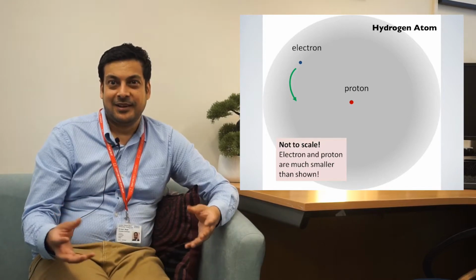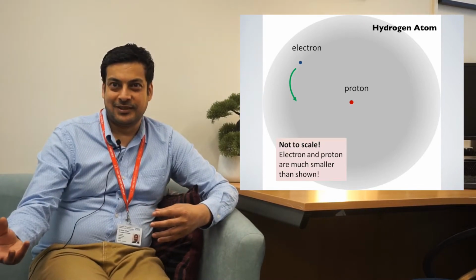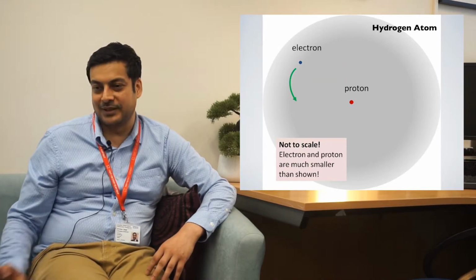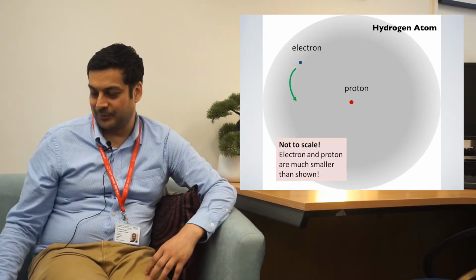So when we say we're using nuclear resonance, if we take hydrogen, we're really just referring to a proton, which makes it more simple. A hydrogen nucleus is literally just a proton. So as I said, for human MRI, we use hydrogen nucleus imaging or proton MRI.